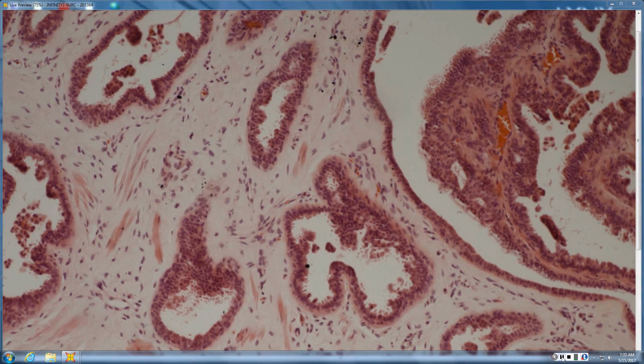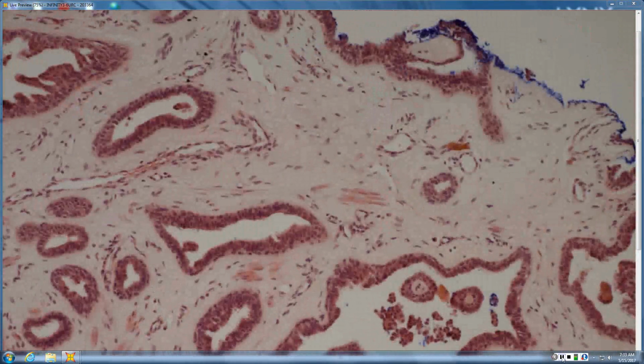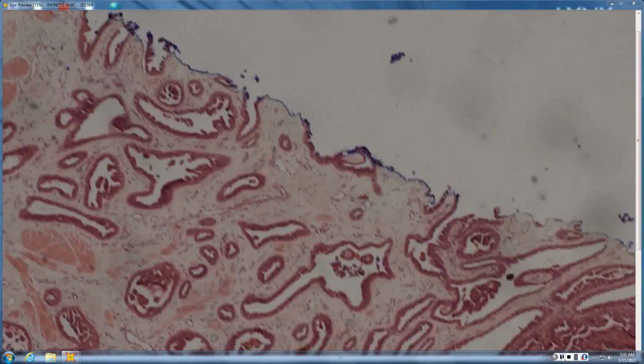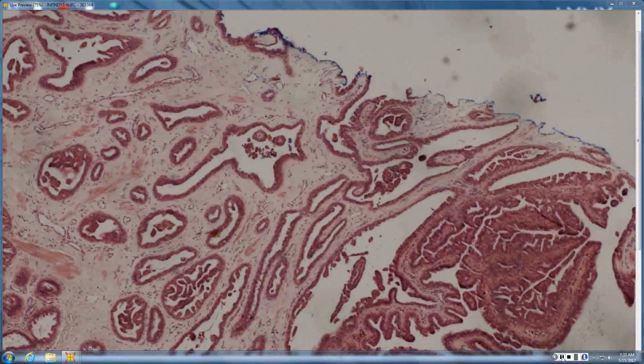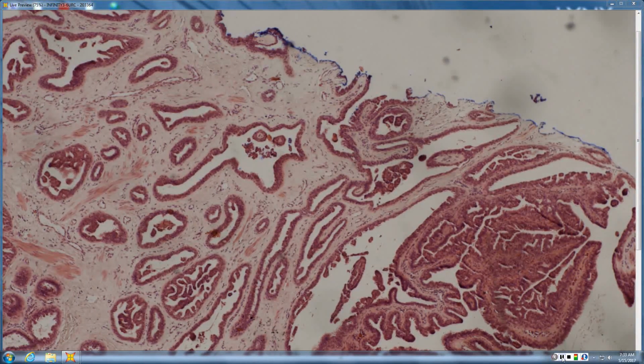Okay. What kind of things are kind of bland and apocrine in a nipple? Looks almost like an HPAP, but sits within the nipple duct. So anyone want to? Nipple adenoma. Yeah. So benign intraductal papilloma, nipple adenoma, erosive adenomatosis of the nipple, they're all the same thing. So erosive adenomatosis is a clinical term. Benign intraductal papilloma, nipple adenoma, they're all synonyms. And it basically looks like an HPAP that is sitting within a nipple duct, mammary duct.